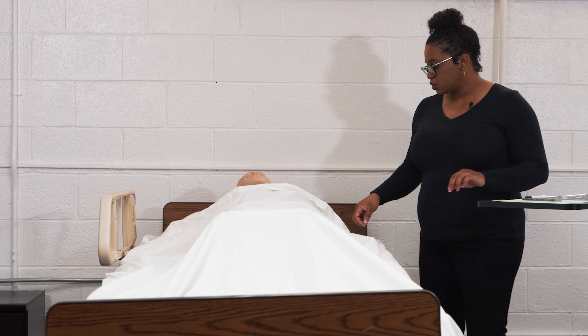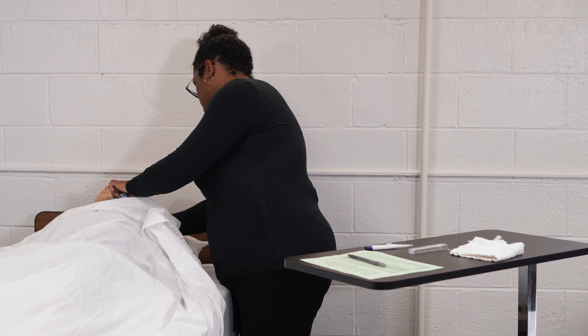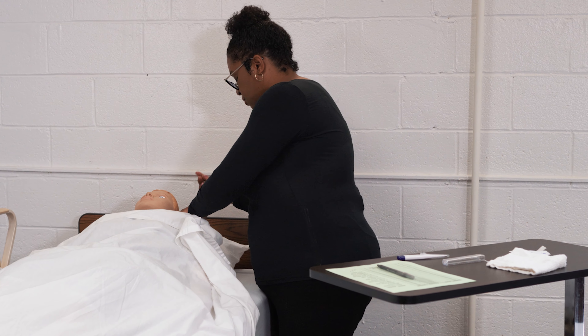Then we're going to remove the resident's arm from his gown, making sure to keep the resident covered.